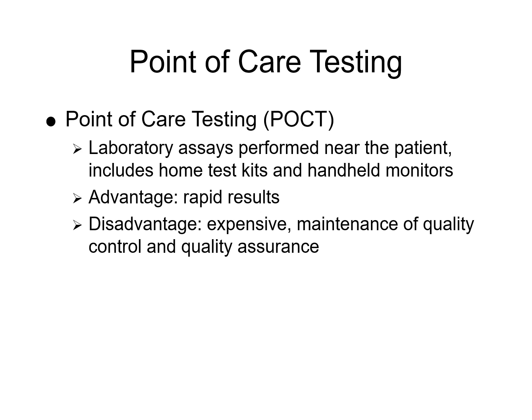Disadvantages of point of care testing is it comes at a higher cost per test compared to batch testing in the central lab. Quality control and quality assurance are also more challenging for point of care. It requires regular calibration of the devices, and personnel must be trained to maintain accuracy and reproducibility. For best practices for point of care, we want to follow manufacturer instructions and CLSI guidelines for point of care testing devices. We're going to maintain logbooks and QC checks and device maintenance, and also make sure we train staff or patients on proper use and interpretation of point of care results.